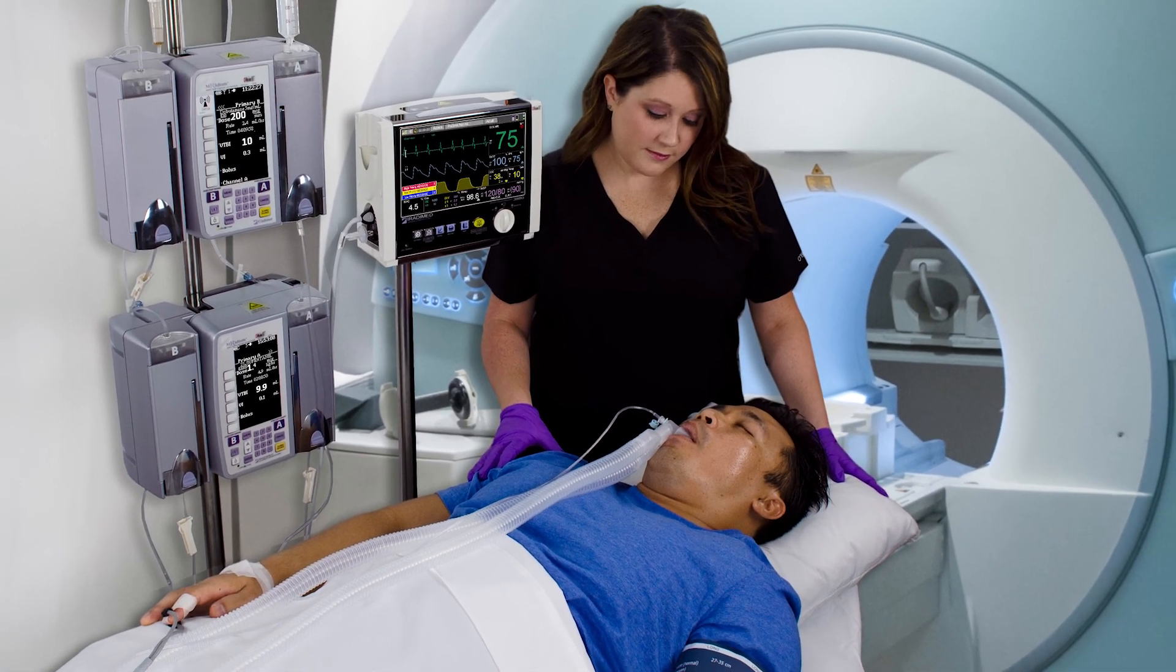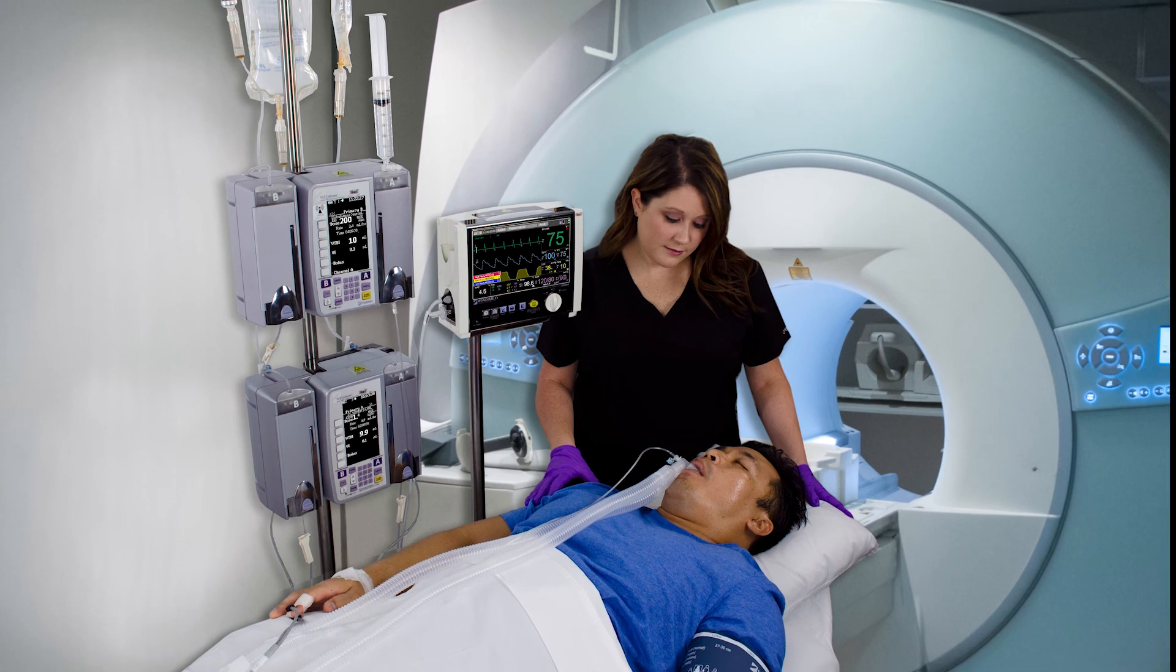As a best practice, it is recommended the hand being used to monitor SpO2 is covered with a blanket to prevent ambient light from potentially affecting the patient's readings.